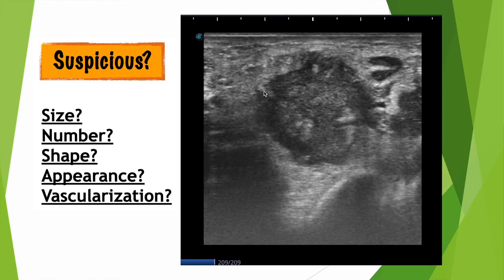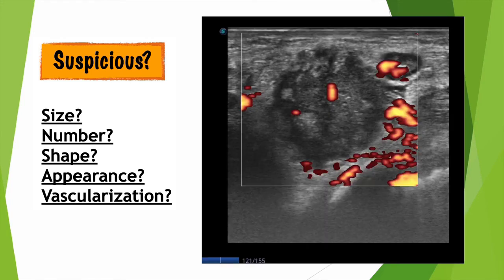And then the vascularization becomes chaotic. There's no more hilar vascularization, which is normally very typical, as you can see here. Here, you can see that the vascularization, even though it's intense, comes from the hilum. Here, the vascularization is no longer really present at the hilum. On the other hand, the peripheral vascularization is extremely significant. All this area of vascularization is starting to become very chaotic.